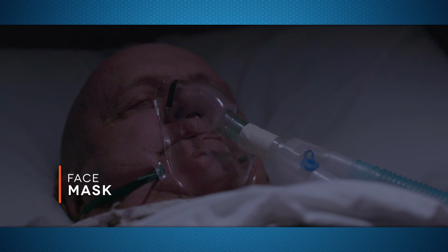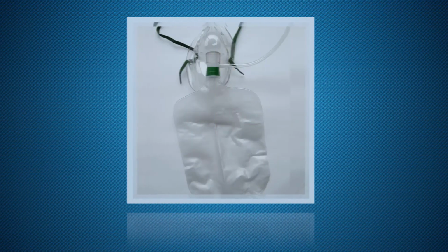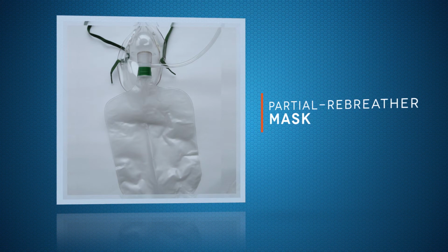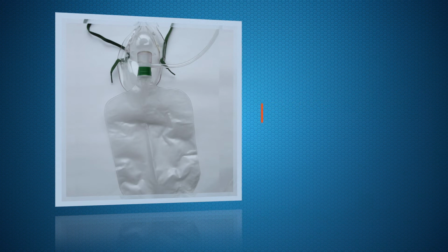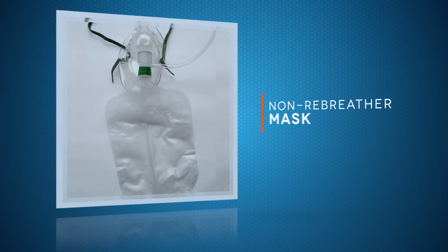The simple face mask covers the nose and mouth. The partial rebreather mask includes a bag that is added to the simple face mask. The bag contains exhaled air. A person inhales oxygen and some exhaled air from the bag. The non-rebreather mask looks similar to the partial rebreather mask.